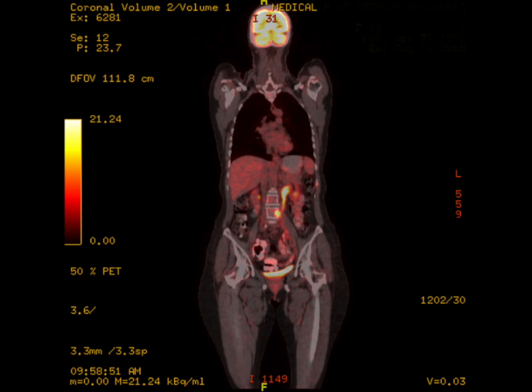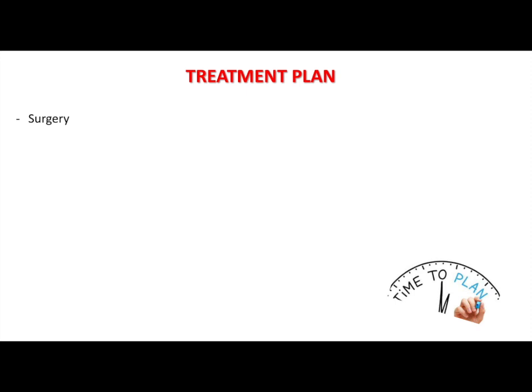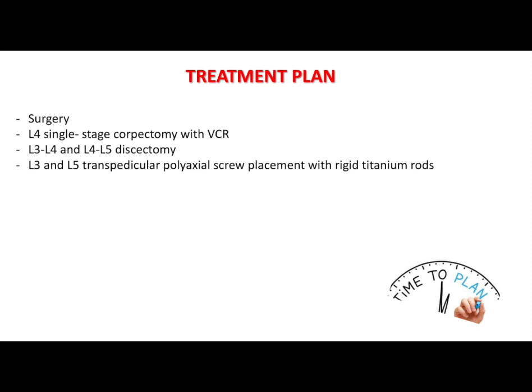After careful evaluation we offered the patient surgery. An L4 single stage corpectomy with vertebral column resection was planned. Additionally, L3-L4 and L4-L5 discectomy with L3 and L5 polyaxial transpedicular screw insertion with rigid titanium rods was performed and an expandable titanium cage was inserted.